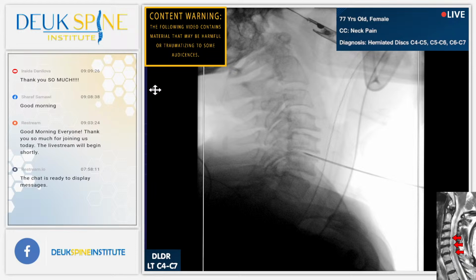We're going to start by doing a discogram. Now let's show the audience right there on the lateral view. Henry, let's go back to the x-ray. Let's show the audience the trachea, endotracheal tube. It has a linear line inside of it, so you can see it on x-ray, but that is the endotracheal tube. And let's show the esophageal probe. The esophageal probe is braided. It looks like a chain, okay? So you have a linear endotracheal tube and a braided esophageal temperature probe. Those 2 lines tell us where the trachea and esophagus are.